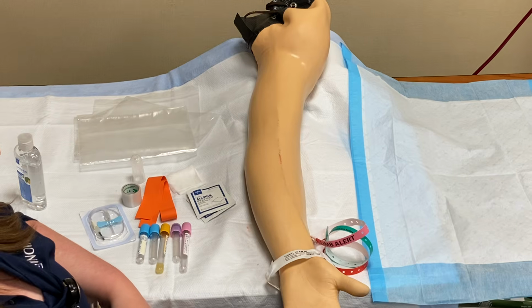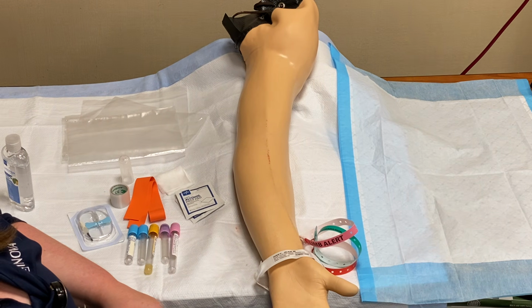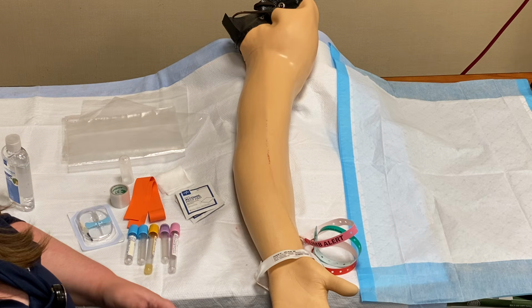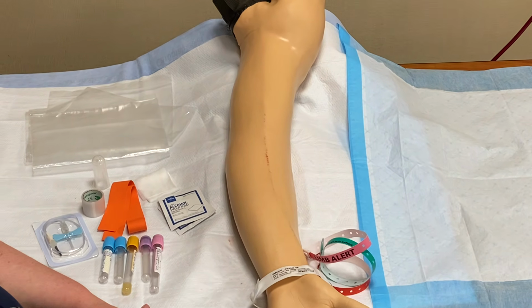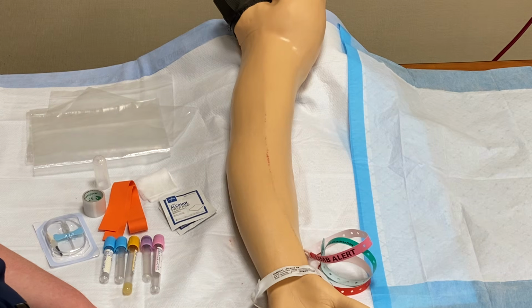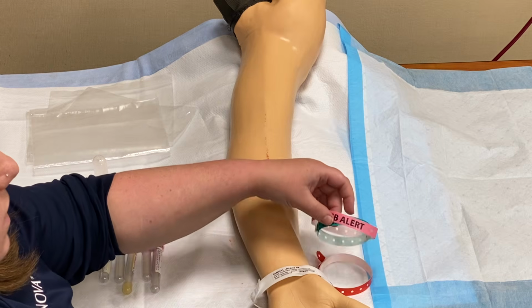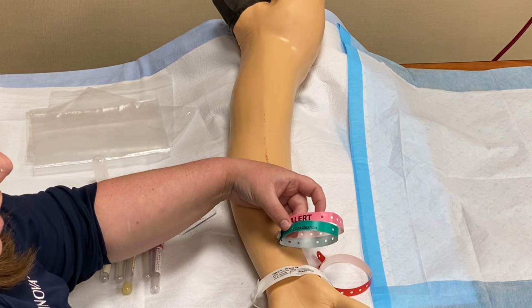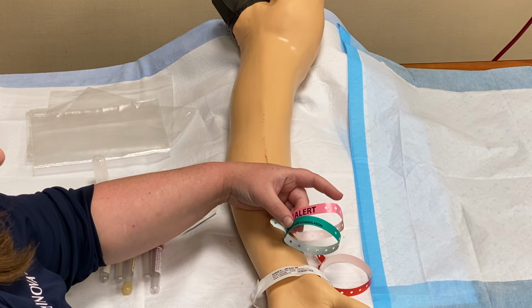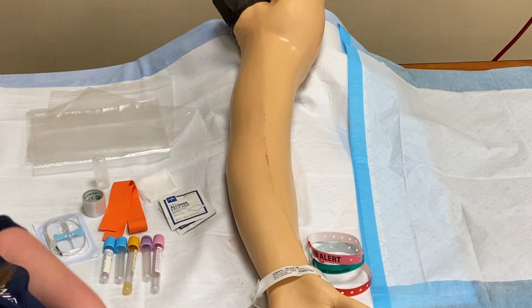If she told me she had a fistula, I'd want to know the location. If she told me she had a stroke, I'd want to know what side is affected. And if she has a PICC line, I'd also want to know where that is, and I'll look at the arm for that. I also want to ask her if she's on anticoagulation, since I'm going to be putting a needle in her arm, and that can lead to bleeding. I do see she has the green anticoagulation bracelet on, and she does tell me she's on blood thinners. So I've asked my restrictions.